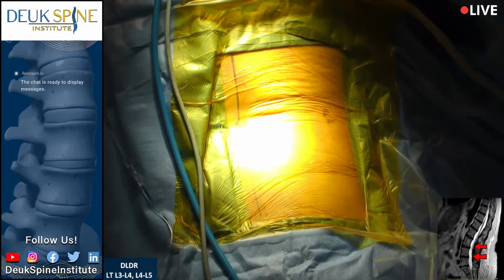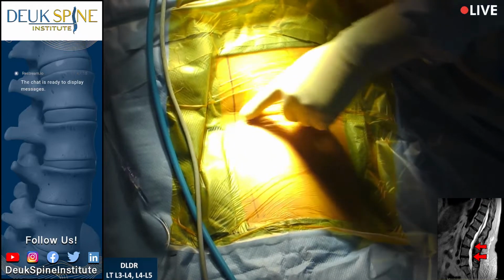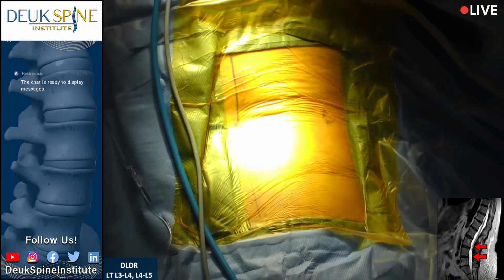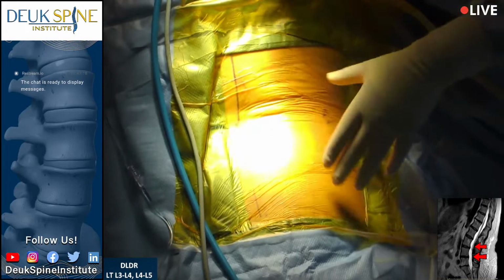So we're going to get started by doing a Deuk laser disc repair to fix the two herniated discs, one at L3-4, one at L4-5. And then we're going to do the Deuk plasma rhizotomy to treat the facet joints on the left side at L4-5, L5-S1. So bear with us as we get started. We're going to start by numbing up the skin.